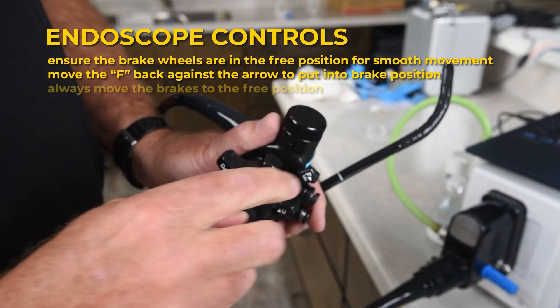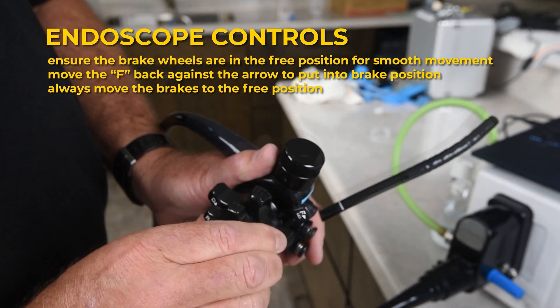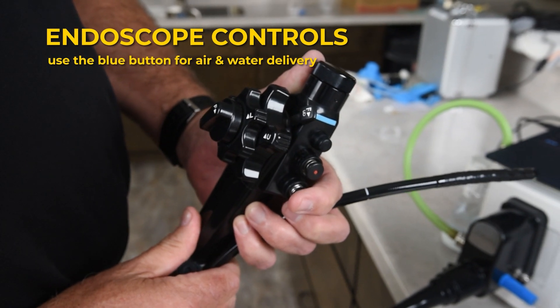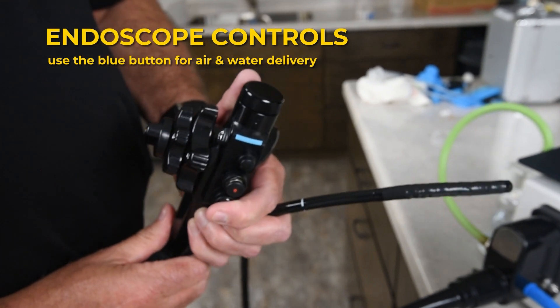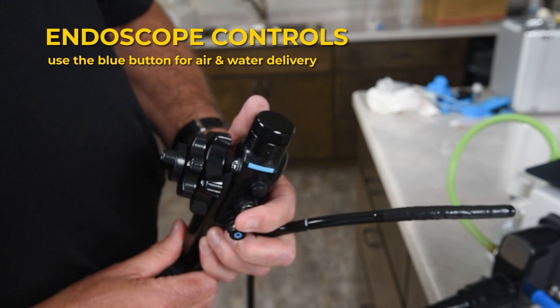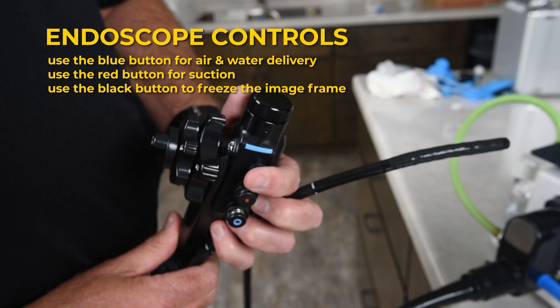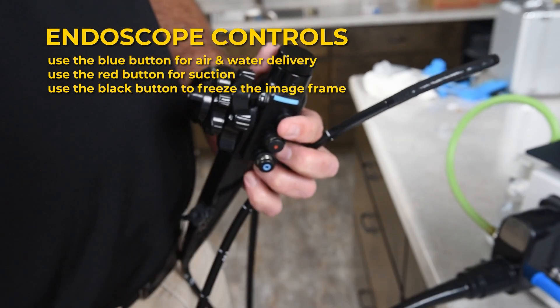Always move the brakes to the free position so that the articulation wheels turn freely. Use the blue button for air and water delivery — cover the hole to provide air, or push the button for water. Use the red button for suction. Use the upper black button to freeze the image frame, the same as the freeze button on the front of the unit.